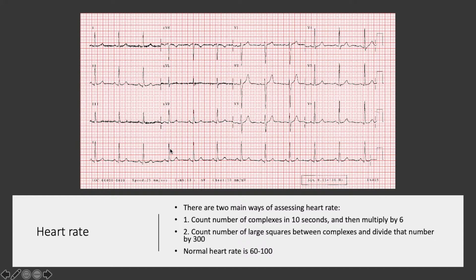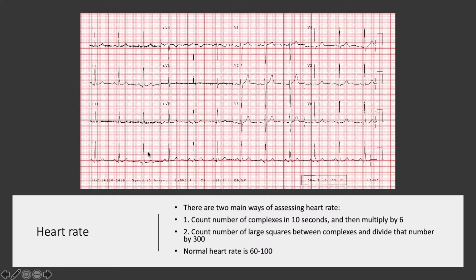Count each heartbeat — in other words each QRS complex — in 10 seconds, and then multiply by 6, which gives you the heart rate over a minute. In this example there are 12 QRS complexes in 10 seconds, and multiplying by 6 you get a heart rate of 72, which is within the normal limits.